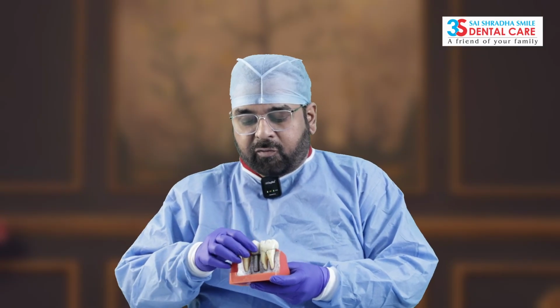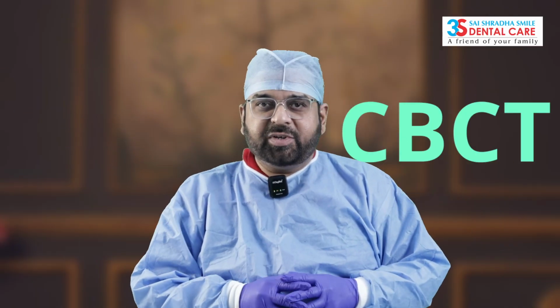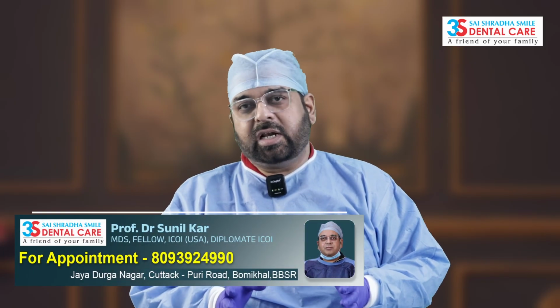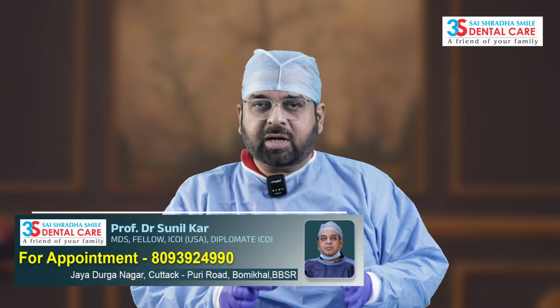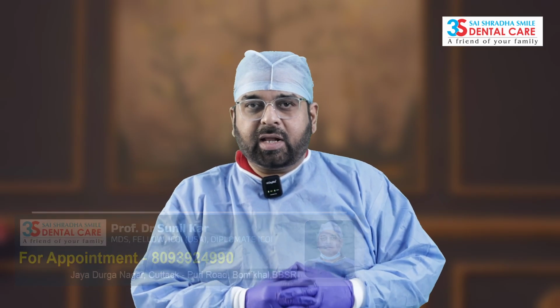Normally when we plan for an implant, we have to check the bone quality of the patient, the age of the patient, and whether the patient is under any medications or not. After checking all these, we have to take a full mouth X-ray, OPG, or go with a CBCT. If everything is perfect, then we select the proper implant angulation. We can use guides or a stent for that. After that, we select the implant size, the proper diameter and proper length, and place the implant in the proper place according to the guidelines.